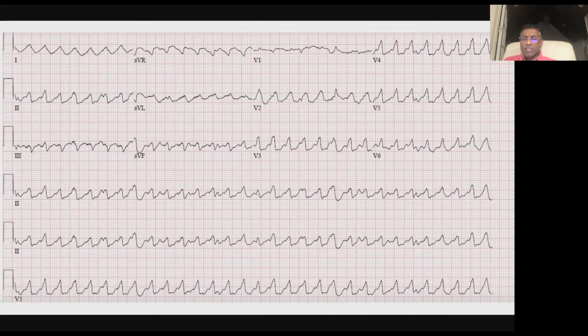VT. Ventricular tachycardia, good. Because the P's, the atrial rhythm is completely dissociated from the ventricular rhythm. It has nothing to do with it, if indeed this is a P wave. I will grant that I can't prove it right now. I'd have to give you some more information to prove it to you, okay? One more feature of wide complex tachycardia that suggests VT rather than SVT.